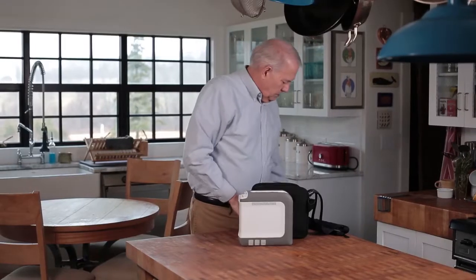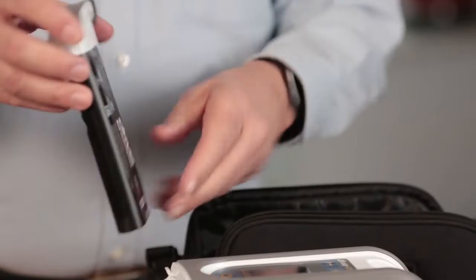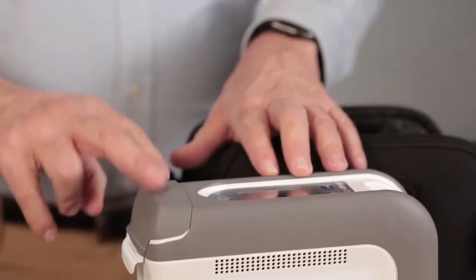Next, let's remove the battery from the packaging. Now, let's insert the battery into the battery bay.